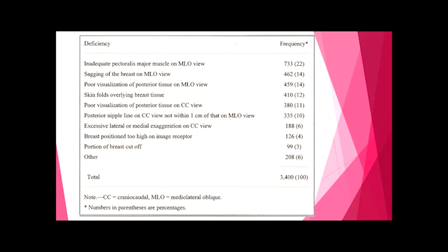And there are techniques and tools. Every patient is different, and so you're customizing the procedure each and every time that you do this, but there are many techniques that a technologist can use to overcome whatever deficiency there is in the image.